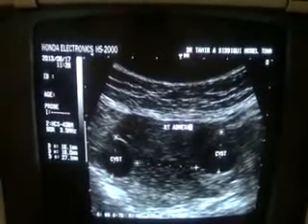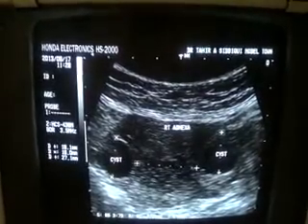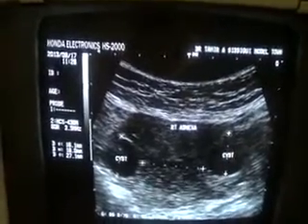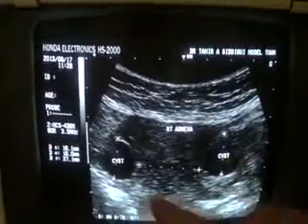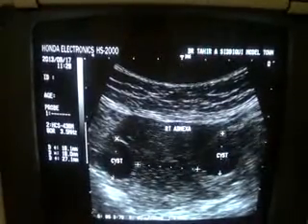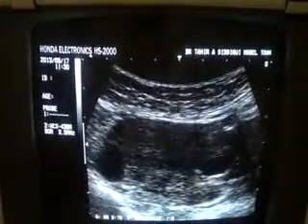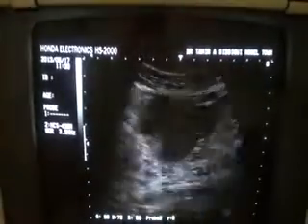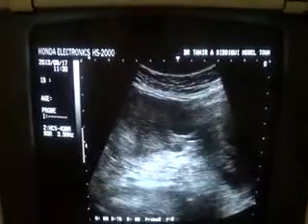And the differential will be that if the pregnancy test is positive and if the beta hCG level is raised, then these two cystic areas are representative of twin pregnancies or two gestational sacs. Here you can see them again. She is extremely tender to this region. The patient is hardly allowing me to place the probe in this region.